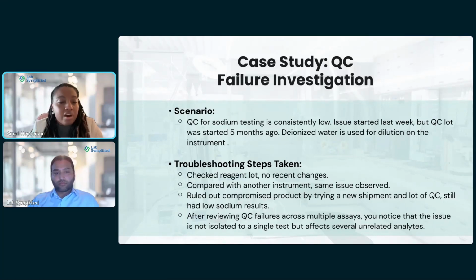Normally, they'll give you charts and values so that you can compare what you're getting, like your SD and CV values, and know what is considered acceptable for that specific assay, because it can be different for different assays. Normally, if it's a little tight, your test system is pretty precise. But sometimes that does cause an issue for customers. When they switch to a different reagent lot, they start to notice that their values are outside of their expected range because their SD is so tight.